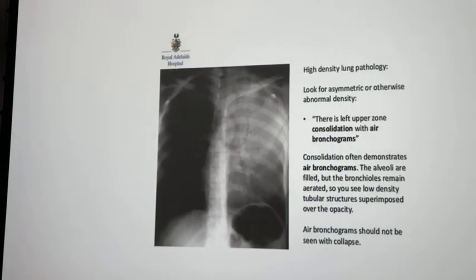So additive pathology is just an example. We've got what should be normal, healthy lung as opposed to completely opacified lungs. In this lung, you see how you can't really see through that very well? Now you can see through it too well, I guess is what I should say. You can't see in lung markings, right?